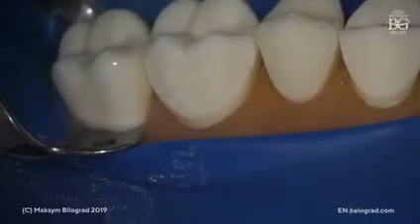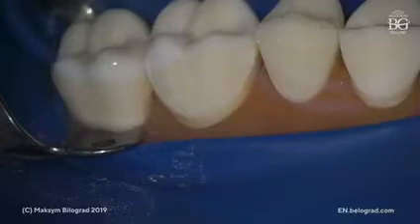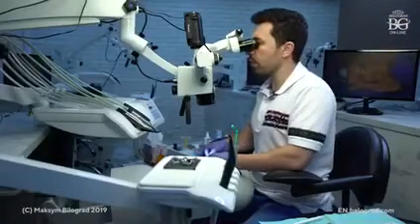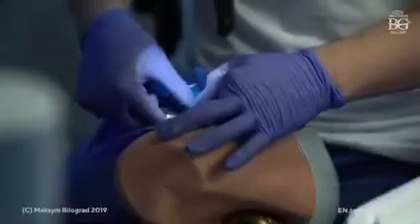Yes, by the way, I forgot to show you before the red burr, before I start preparing teeth with the red diamond, before the second stage of preparation, I need to control the depth of preparation. Did I prep enough or not enough? For this, we are using silicone indexes. For posterior teeth, we are using a classic silicone index as we use for crowns, for example. This is a full coverage silicone index, occlusal, buccal, and lingual, you see. Then we cut the silicone index sagittally, so you will be able to see this part of the tooth. So let me put this silicone index on my preparations.